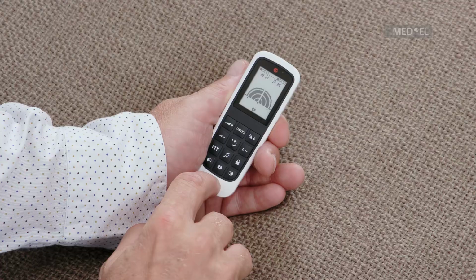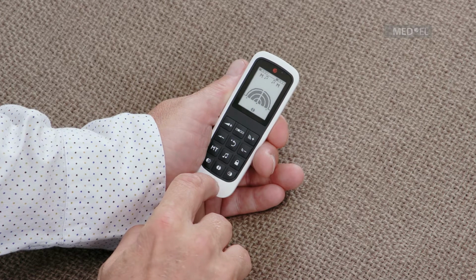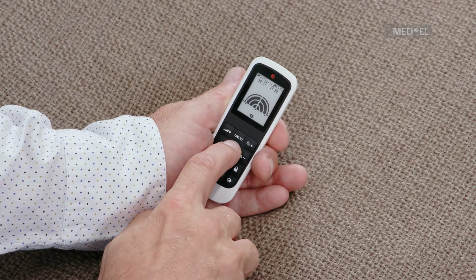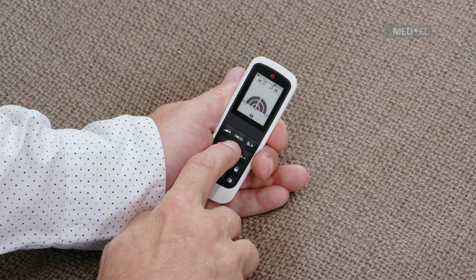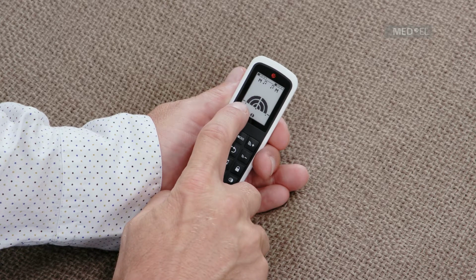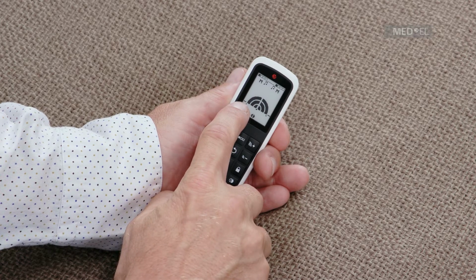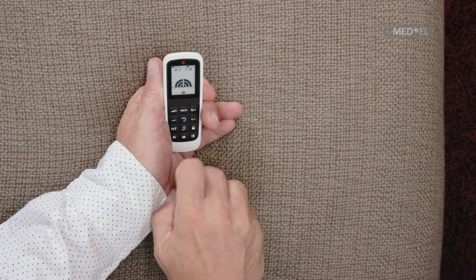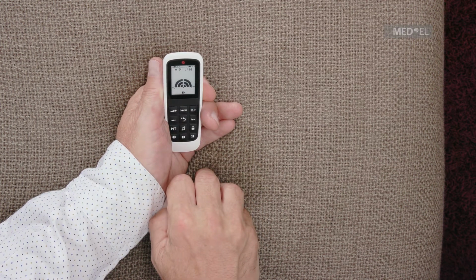The default key sets volume and sensitivity back to predefined values set by your audiologist. Pressing default will not change your program. To select a program, press the Program Selection key. The bar at the top of the screen indicates which program you are currently using.